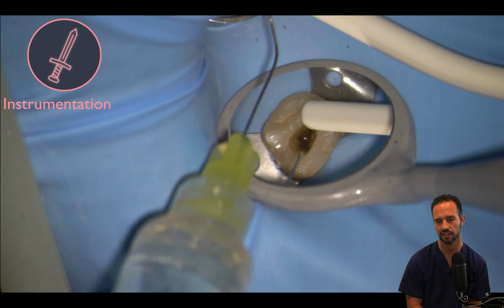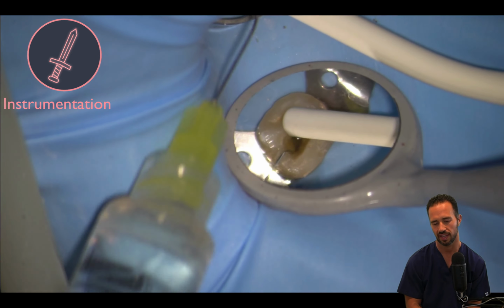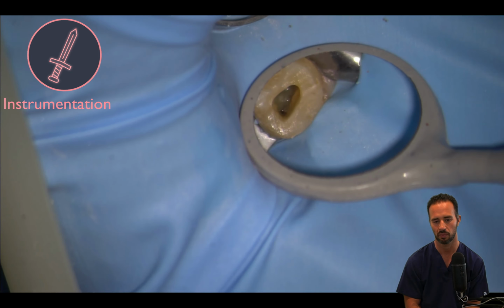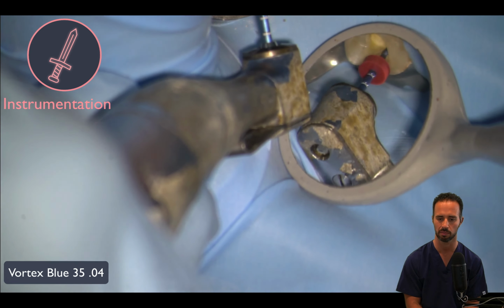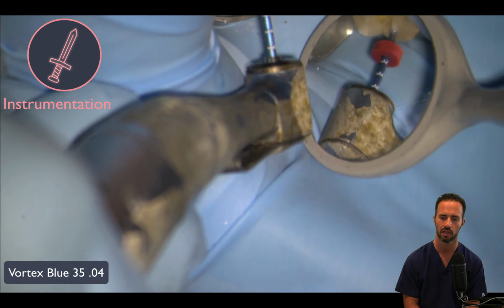Remember, I didn't want to edit these down too much for you, because I want to give you a realistic representation of how these cases go, and not make you think that these are five-minute molar endos, right? So now we are up to our 35/04 Vortex Blue to 18 millimeters in the MB.